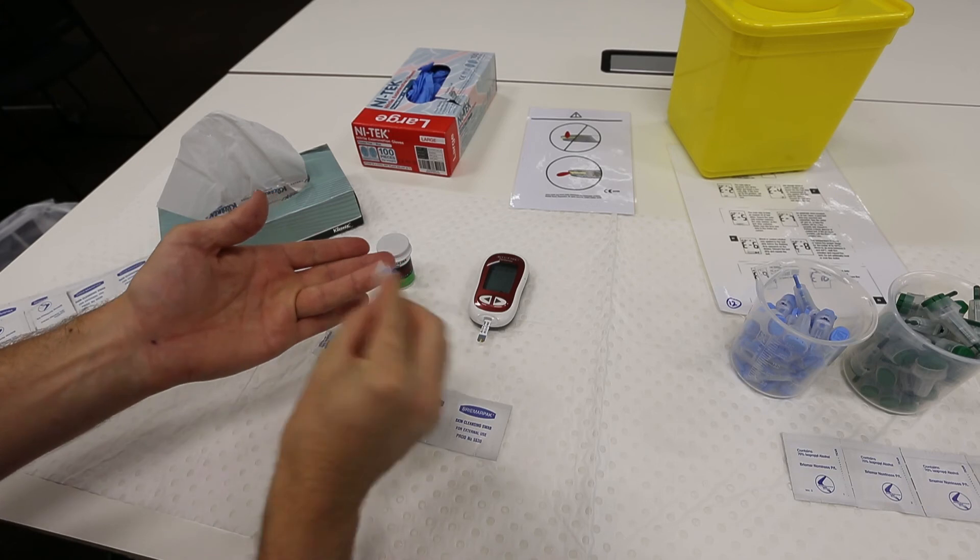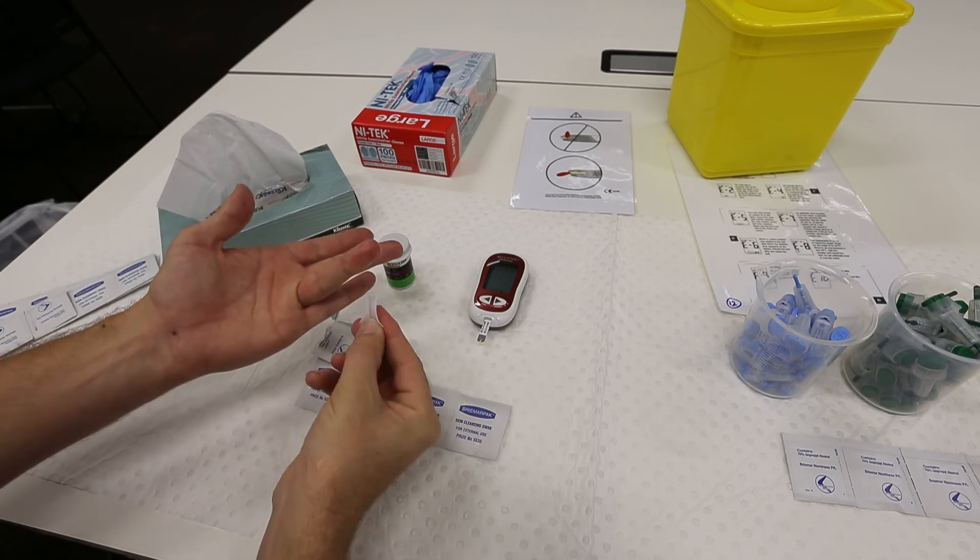Here I am using my non-dominant hand, and I have also chosen to use my ring finger, which I tend not to use as much.